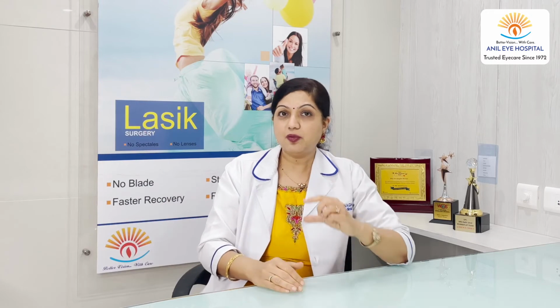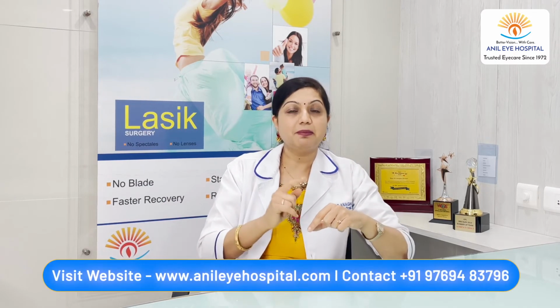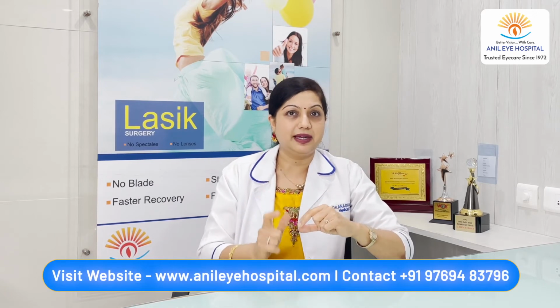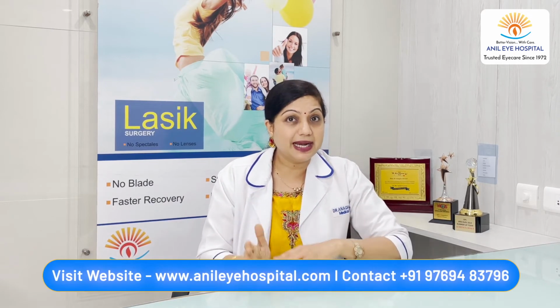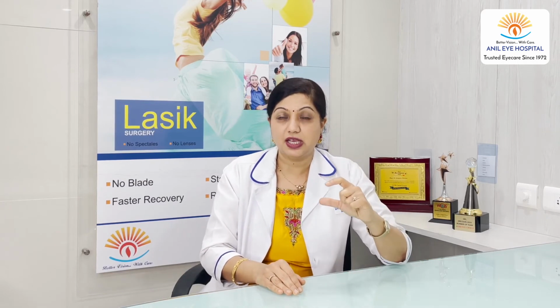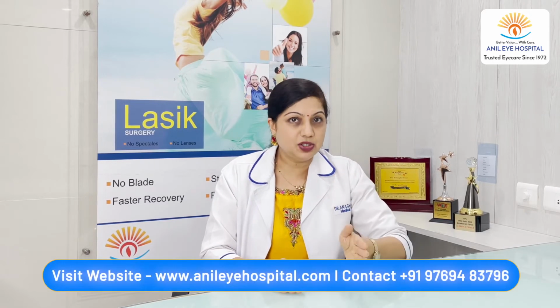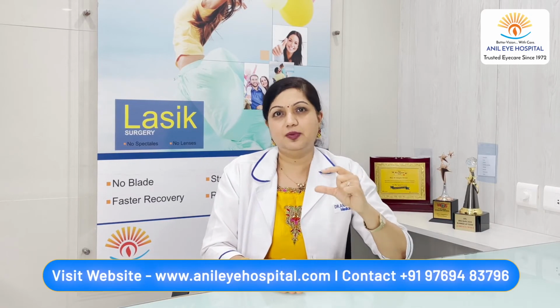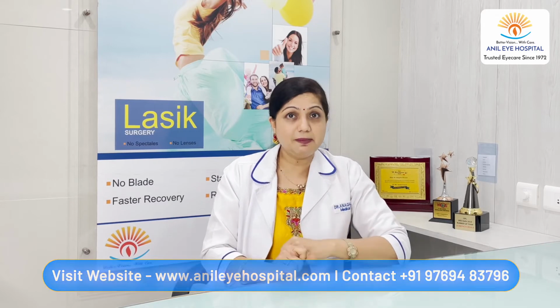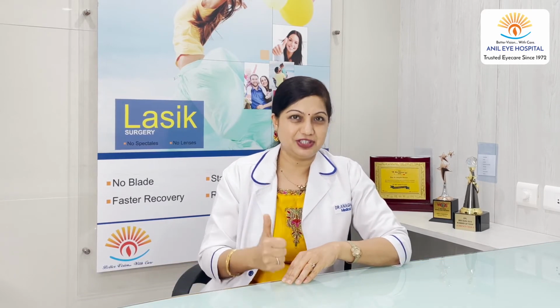So if I want 100 micron flap for you, and if I make it a computer calibrated procedure with the bladeless laser, then you will get an accurate 100 microns. Whereas with a blade procedure, because it is a manual one, there can be a little variability. So with the bladeless procedure, the accuracy and the precision is much higher.